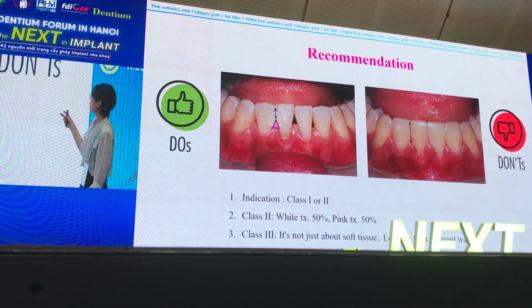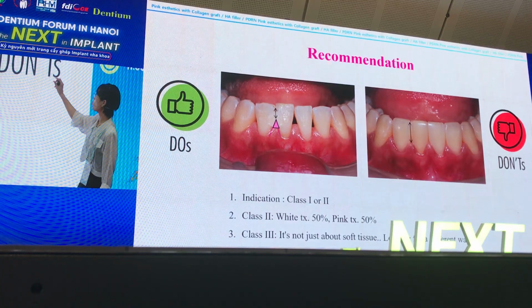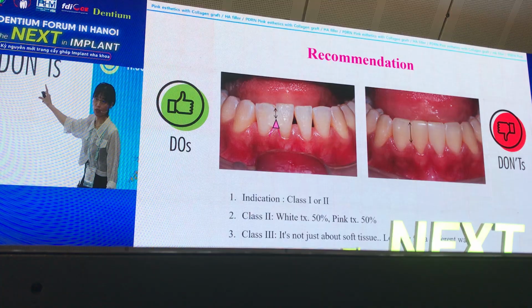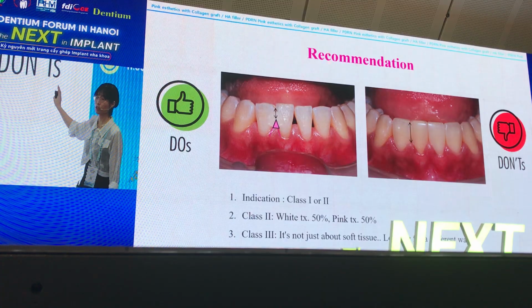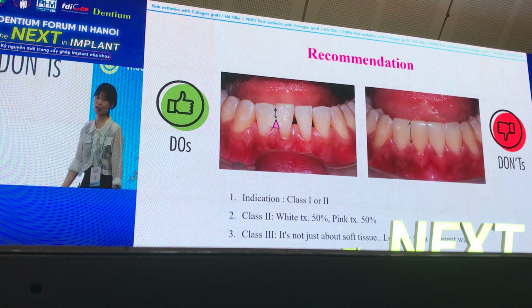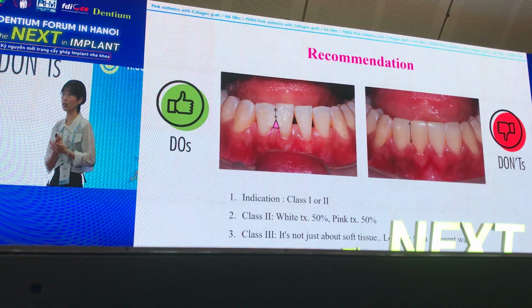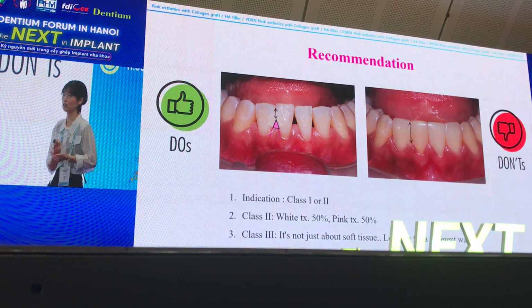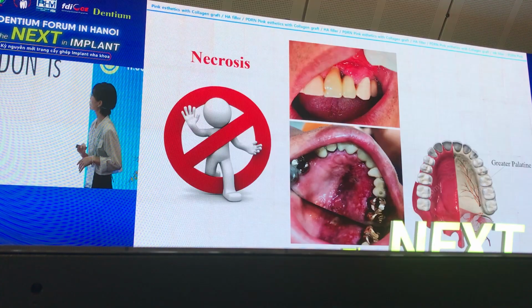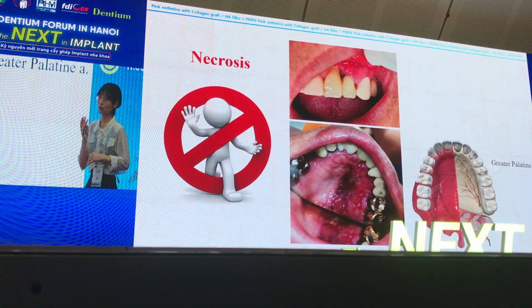Okay, so you can make a proper contact point, no more contact line, because otherwise you can induce gingival inflammation and bone reduction and the cycle repeats again. So I recommend doing black triangle treatment using HA fillers. But we have to think about the side effects, right?